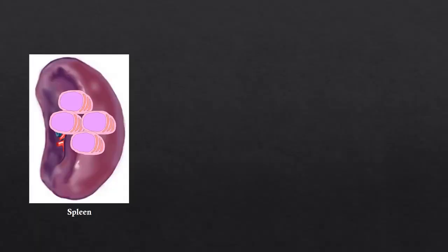Therefore, it is not surprising that multiple antibody flavors are found in the serum. Due to the use of antibodies that target multiple epitopes, these antibodies are called polyclonal. Polyclonal antibodies target multiple epitopes on the antigen that was presented to the organism. However, cultivating antibodies in an organism is an arduous task.